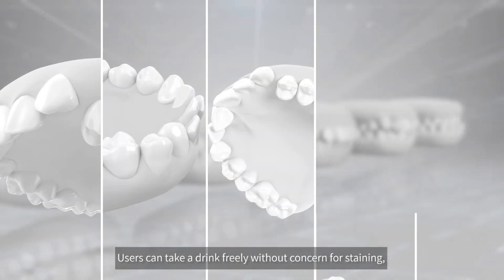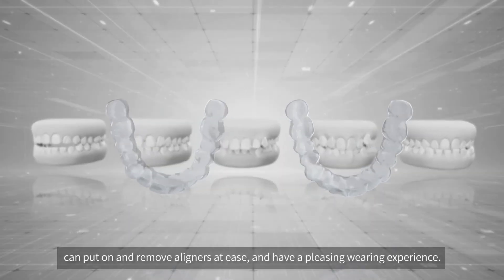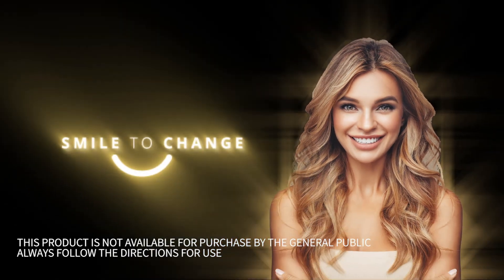Users can take a drink freely without concern for staining. Put on and remove aligners at ease and have a pleasing wearing experience. Smile to change.